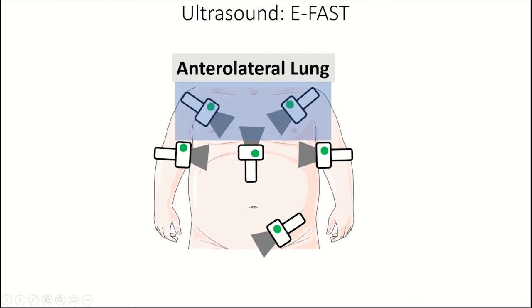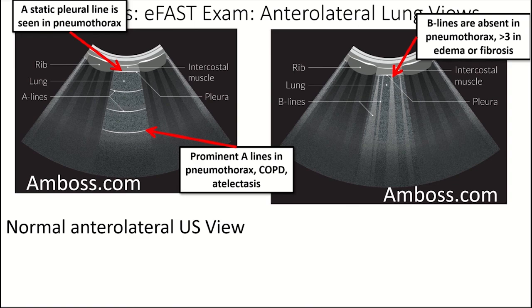The EFAST adds bilateral anterolateral lung views to check for pneumothorax or hemothorax. Here is a normal anterolateral ultrasound view. We see some ribs with rib shadowing, and then the lung, which looks like static from a TV. There are things called A lines and B lines, and the white area here is the pleural line.